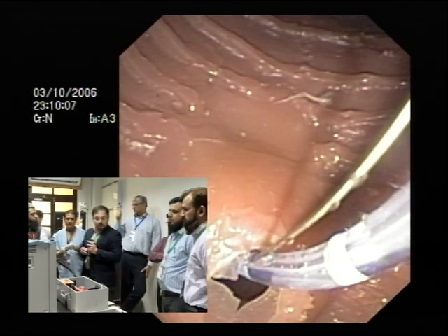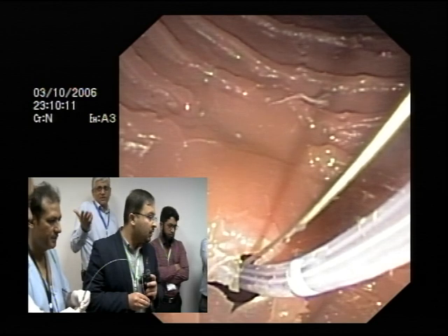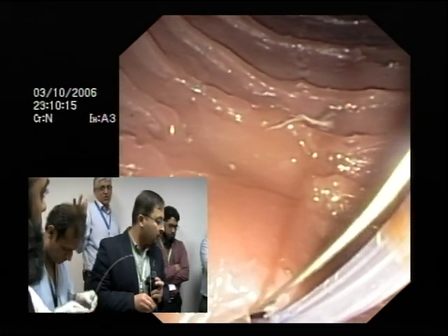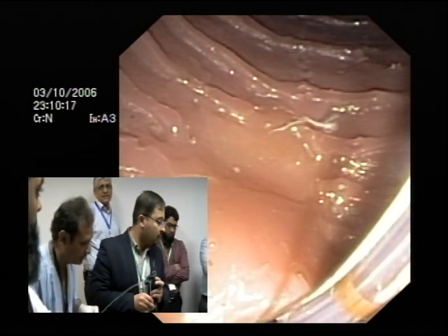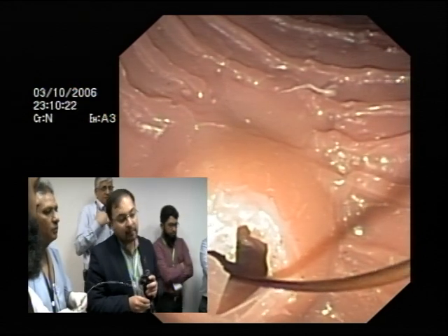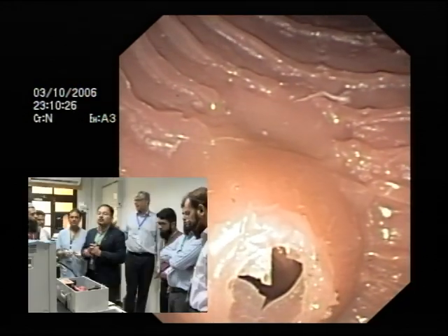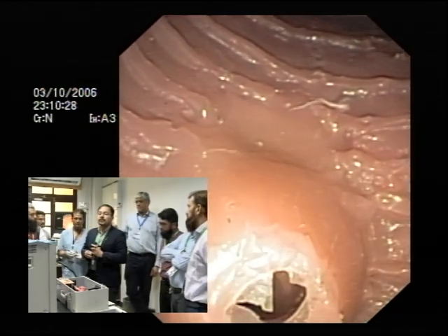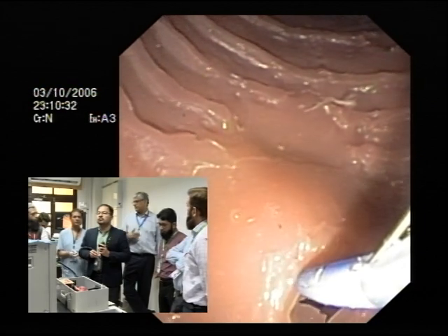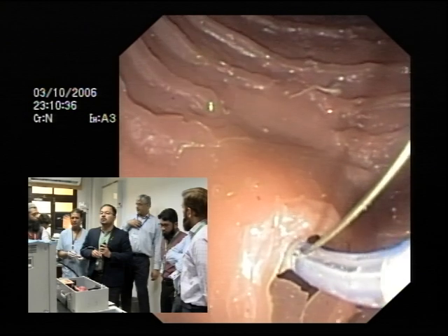So we use cannulotome. I mean, nobody will object if you use a cannula, but it saves time, it's less fluoro, it's less accessories, cost effective. So for us, it works everywhere. And to me, it's easier to cannulate with the sphincterotome, especially most of the time you want bile duct. If you want pancreatic duct, then you can. And now also for pancreatic duct, I use sphincterotome. I very rarely use cannula if I'm stuck. So that's our practice.